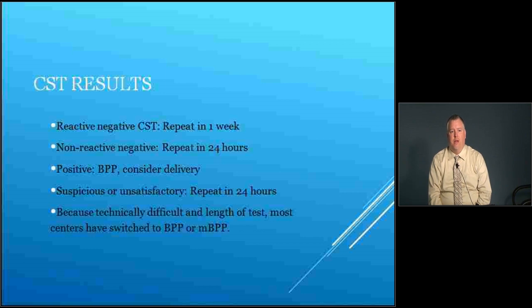So if we have a reactive negative CST, that means the NST was reactive, the CST was negative, we would just repeat that in a week. If we had a non-reactive negative, meaning that our NST was non-reactive and our CST was negative, we would need to repeat that in 24 hours. If we have a positive CST, we would either consider doing a biophysical profile or we would consider going ahead and delivering the baby. With a suspicious or unsatisfactory result, we would repeat testing in 24 hours.